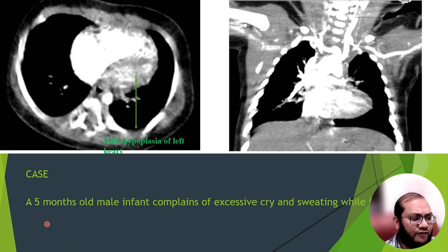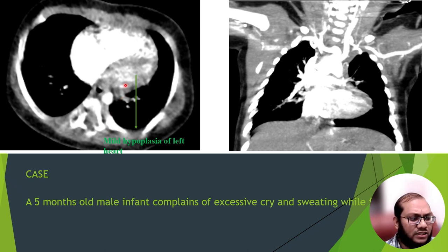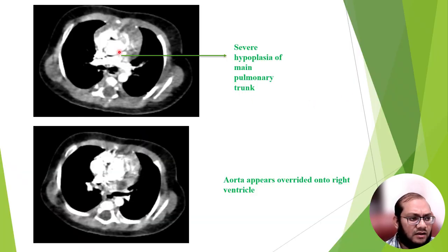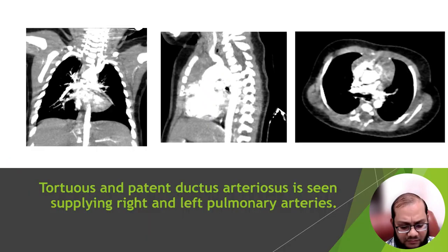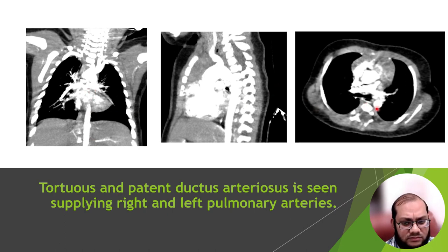In this case, a 5-month-old male infant presented with complaints of excessive crying and sweating while feeding. On the axial CT images, we can see the left side of the heart is hypoplastic, and the pulmonary trunk is also severely hypoplastic. The ductus arteriosus here is patent and it supplies both the left and the right pulmonary arteries.